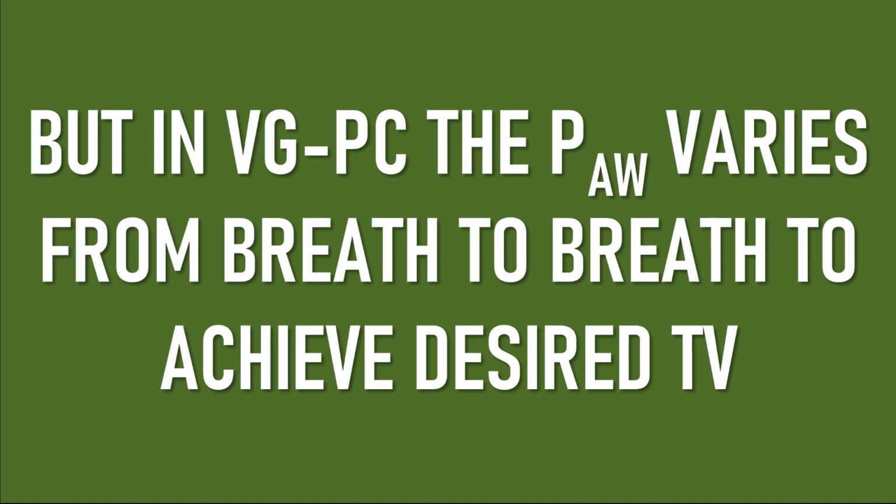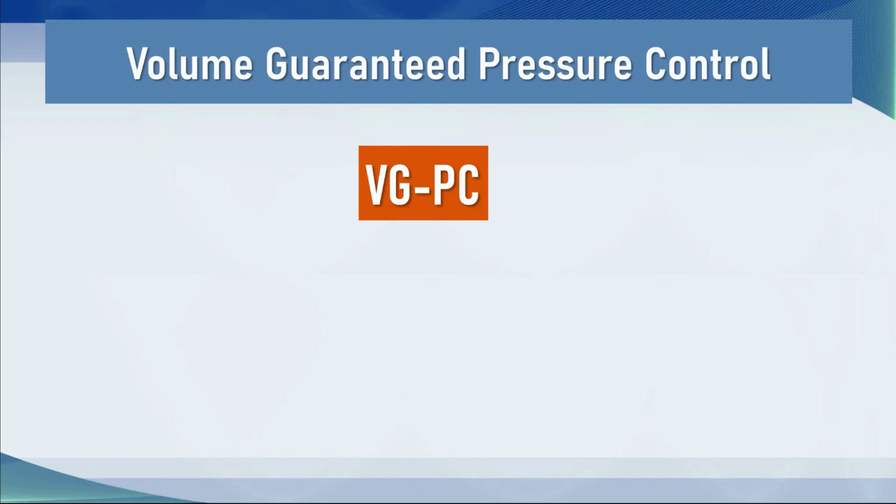Now this is different from pressure support, because in pressure support, the inspiratory pressure level is always achieved, and the change from breath to breath is how much the patient generates in their own inspiration. In this mode of ventilation, the machine is trying to give the same tidal volume all the time with changes in the pressure depending on the patient's position, compliance, and resistance.